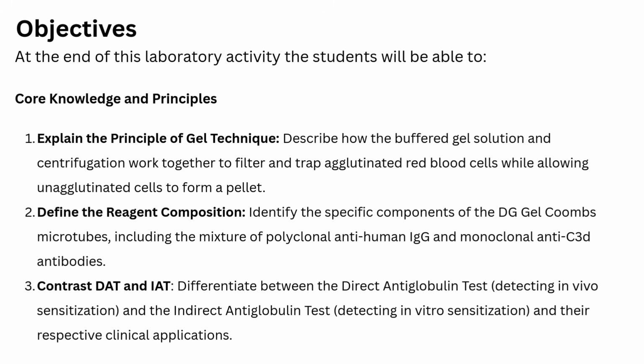For the objective, at the end of this laboratory activity, you as the students must be able to, based on the core knowledge and principle, explain the principle of gel technique. So describe how the buffer gel solution and centrifugation work together to filter and trap agglutinated red blood cells while allowing unagglutinated cells to form a pellet.